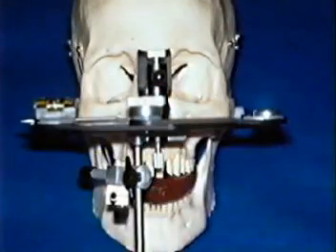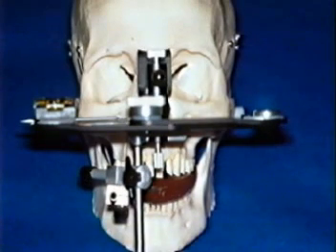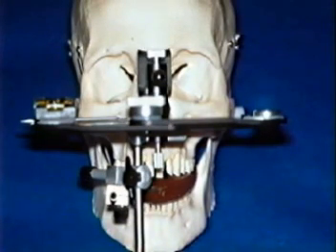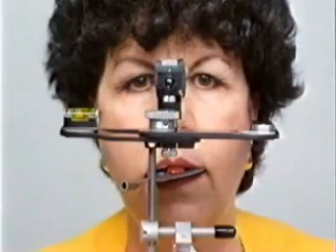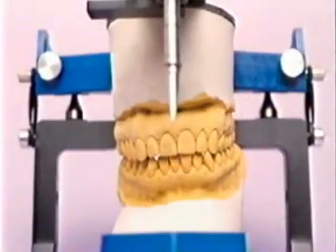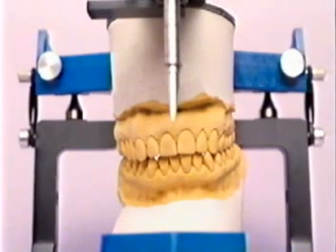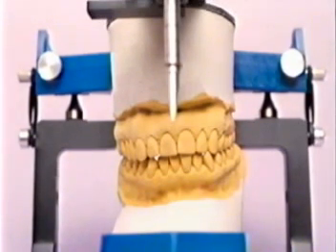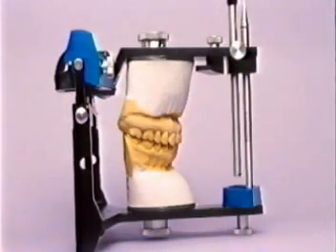In addition, the aesthetic information — i.e. the maxillary occlusal plane — may be transferred improperly if the patient's ears are uneven or the third point of reference is inappropriate. These concerns will slant the maxillary arch incorrectly, left to right in the transverse plane, or front to back in the sagittal plane.